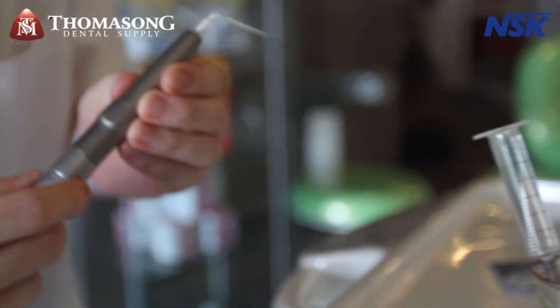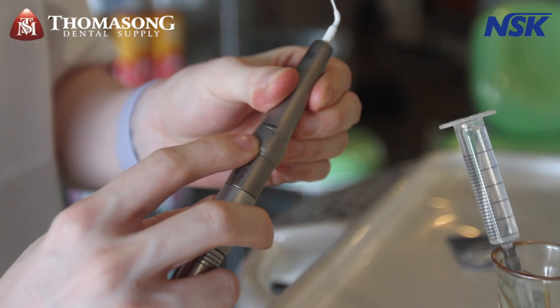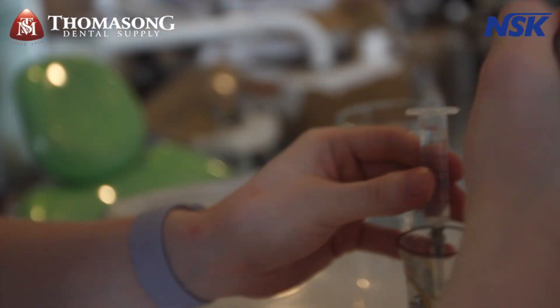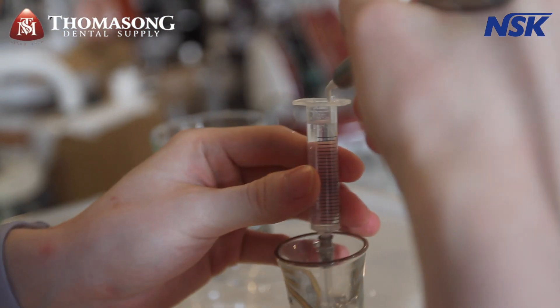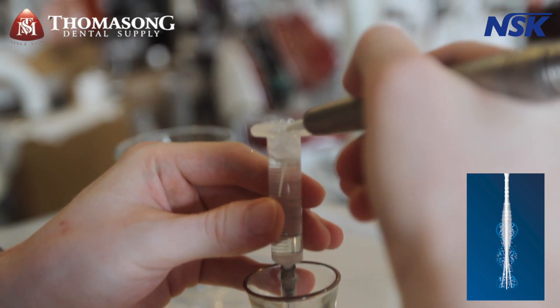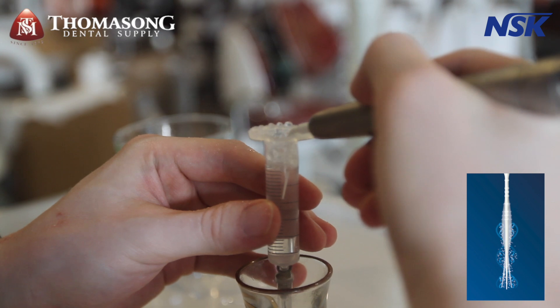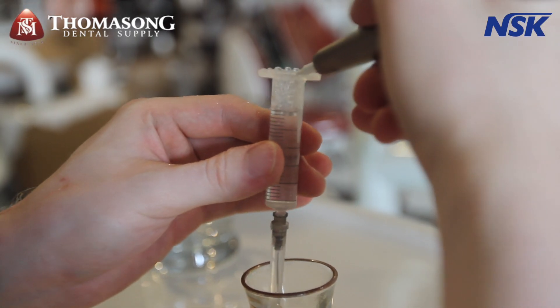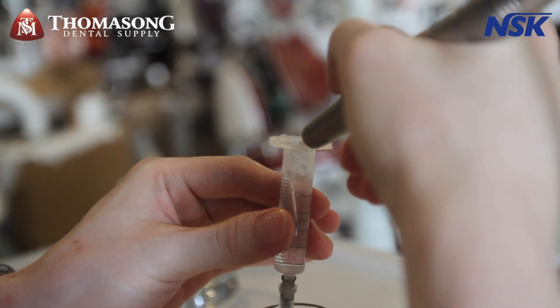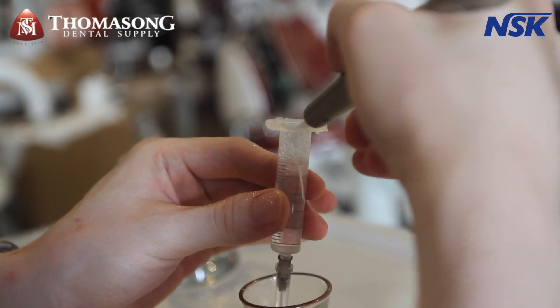I'll move it up to the higher setting now — we're at maximum. See all the bubbles! That's the benefit of using Eddy — you can really clean the canal. The water is just full of bubbles, and you would move it up and down. Really, really good. This is at maximum setting.